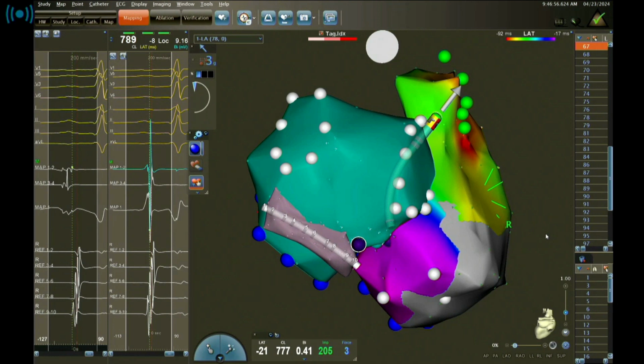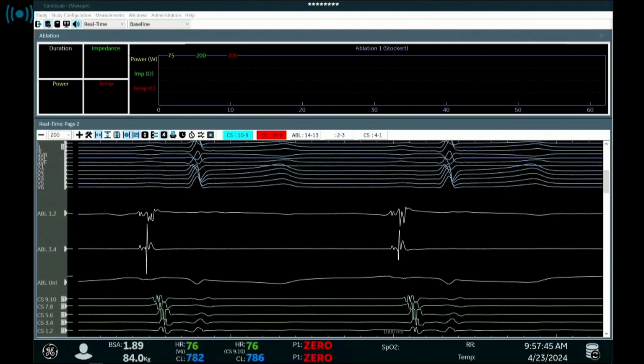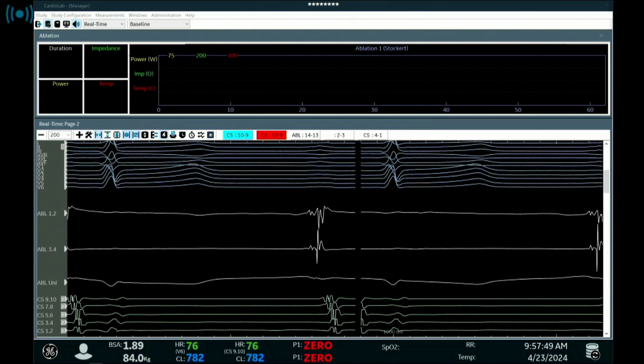So we also performed the extracardiac vagal nerve stimulation the way that we are doing in ECAM, and Roman will show you his way. So let's show the stimulation, please. Review. Can we show a review?